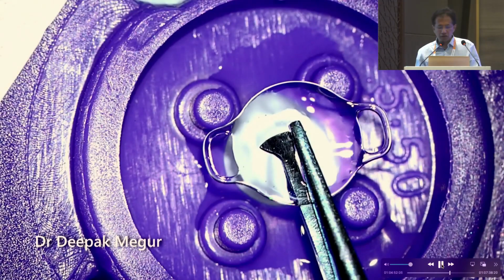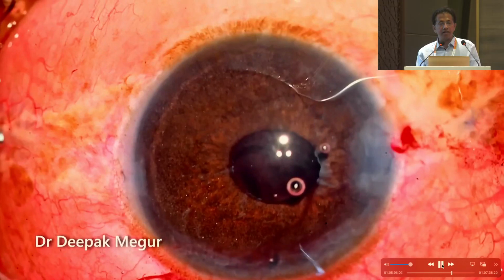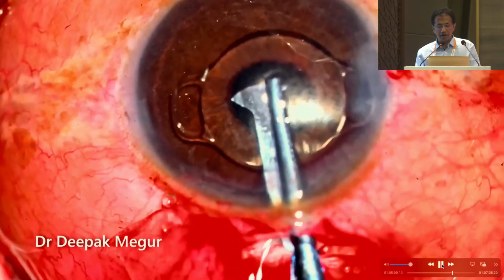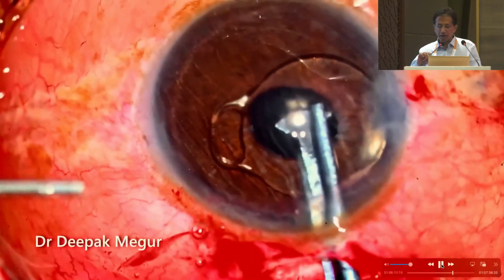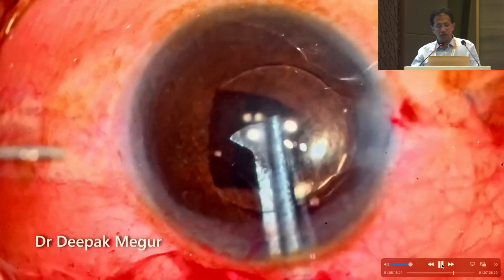Again, the position of the forceps, this is a different forceps. This is the traditional iris claw lens forceps, with the broader plate which we have. Look at the alignment where I'm holding. This ensures that I can now visualize under the iris where the claw actually is. So you're introducing it again, and once the haptic is underneath, the haptic is pushed against the iris, so the iris comes up.